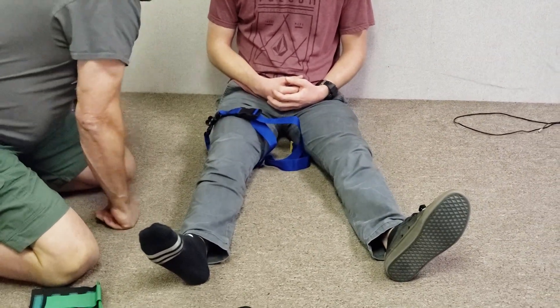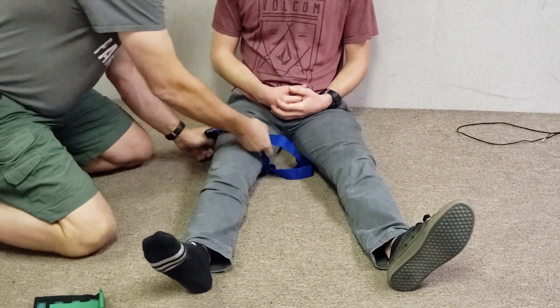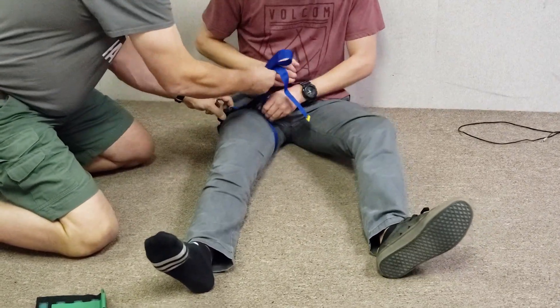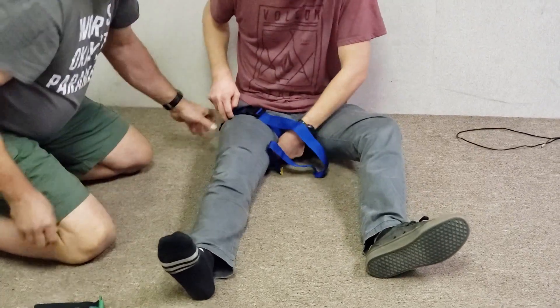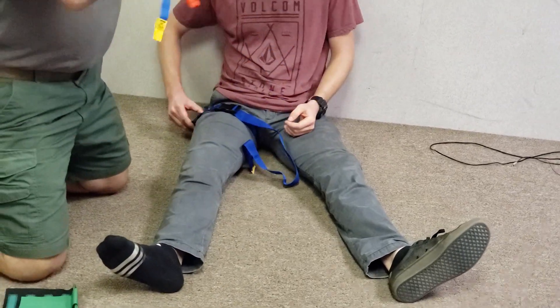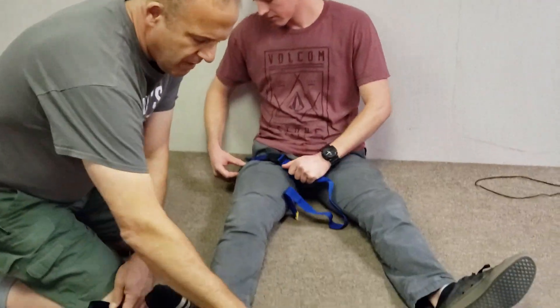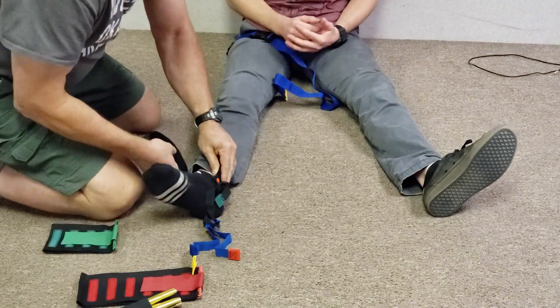The thigh strap should be the very first strap you put on. It's very easy to place and it's critical. Since your patient will almost always be oriented and conscious when you're treating a femur fracture, have them help you in terms of clearing their area or whatever else might get in the way.